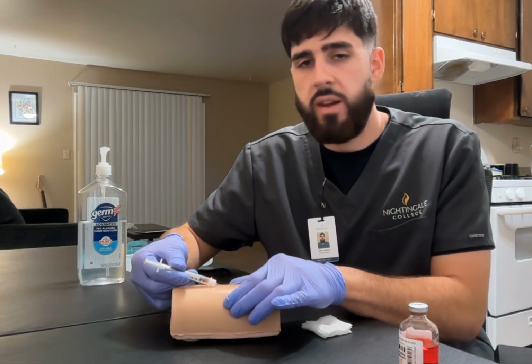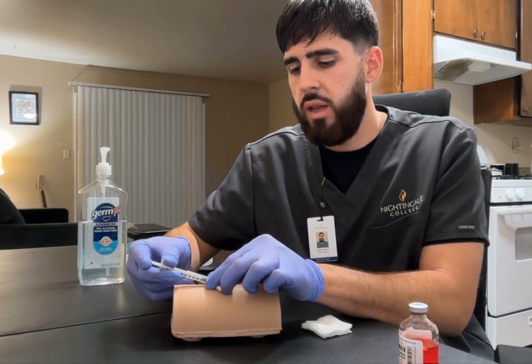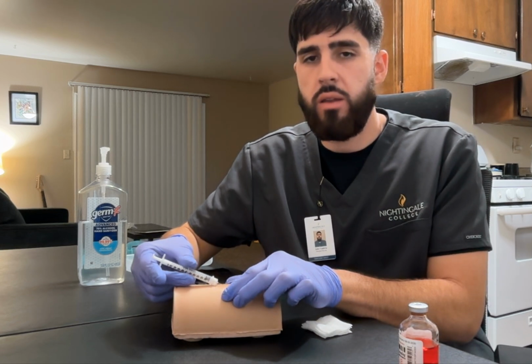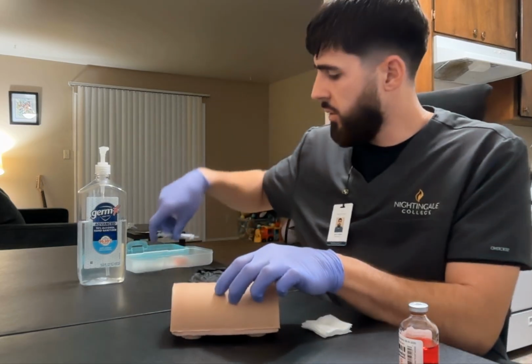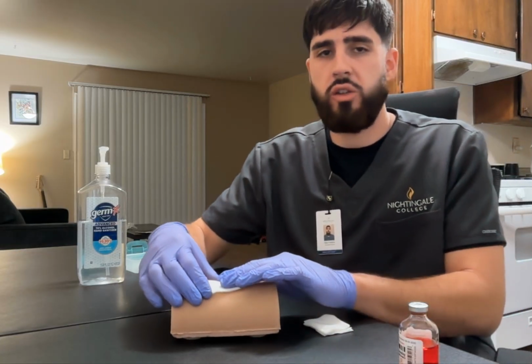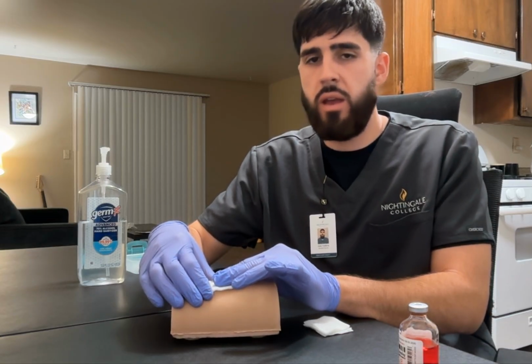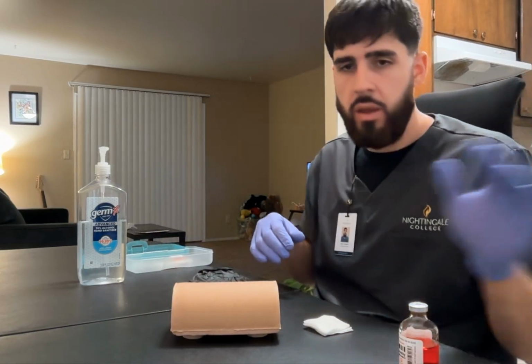Okay, now that I have that ready, I'm going to stabilize the syringe and inject the medication. Now, you should see a wheal or a bleb on the injection site once you have administered the medication. Now you're going to remove the needle, grab a gauze pad, and place it over the injection site. You are not going to apply any pressure, but just let any excess medication that comes up from the injection site be absorbed by the gauze pad. Go ahead and throw that away.